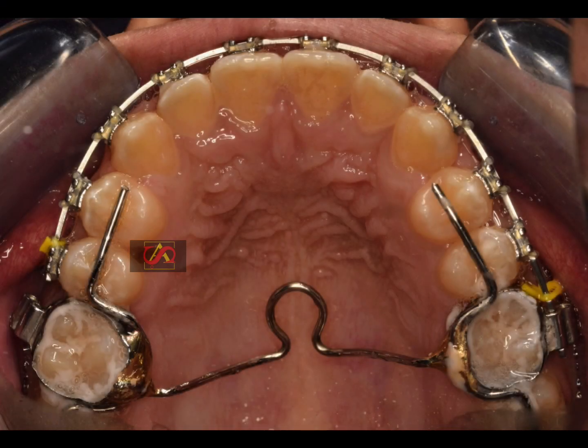The design of this appliance has an arm that rests on the occlusal surface of the buccal segment, which extends from the 4, 5 and 7, and has a TPA to avoid buccal rolling of the upper posterior teeth, because the force application is buccal to the center of resistance of the sixes.